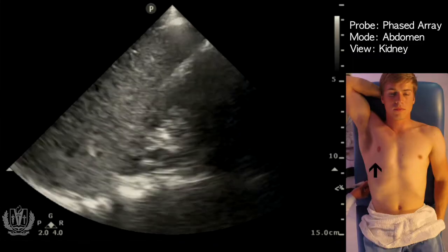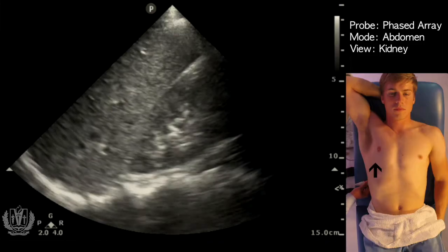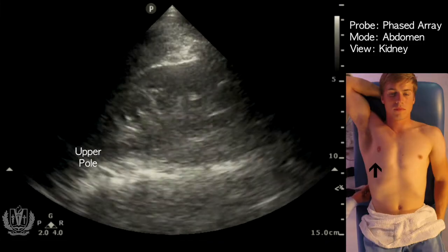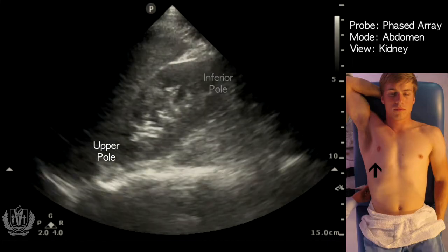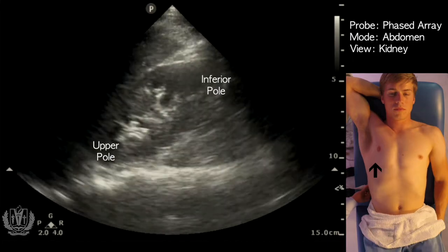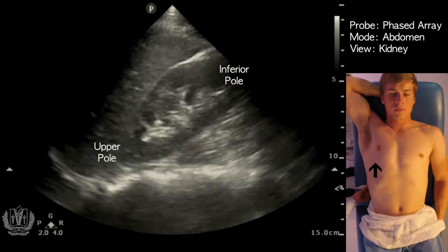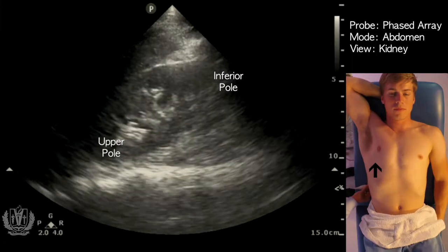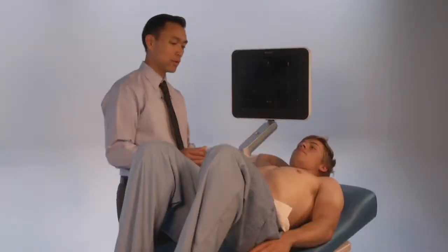Here we can see the right kidney — the upper pole — and as I bring my probe down I can see more of the center of the kidney as well as the inferior pole. You'll notice that as the patient breathes, the kidney moves, so sometimes you can have the patient breathe to optimize your view. That is the right kidney, so now we're going to go over to the left kidney.